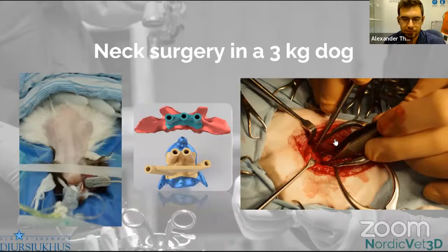And as you can see on this right image, the surgeon can barely fit his fingertip inside the wound. And if we put in just the guides, they're so small that you are able to see the structures around. So it's easier for a surgeon not to have things in the way here.